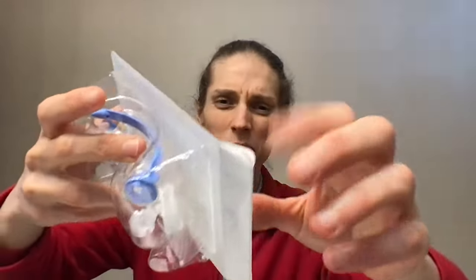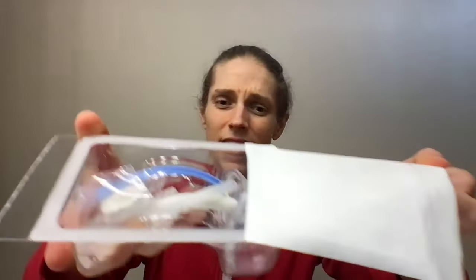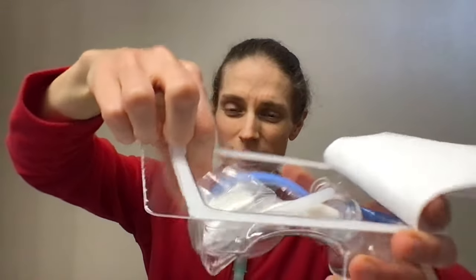Okay, I am now going to open my tracheostomy tube, and this can be a little tricky because I can never get these open. This is the hardest part of it, and you sometimes want to get this little corner here, and it doesn't always come. But today, I'm in luck because I'm taping and I don't want to look like a fool. All right, open. I'm going to set that over there because I'm talking and I don't want to get my spit onto it. So the next thing I am going to do is get this obturator out. It's right here, this blue thing, and it's very difficult.